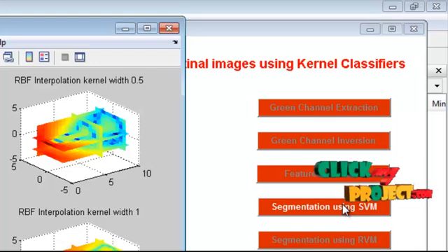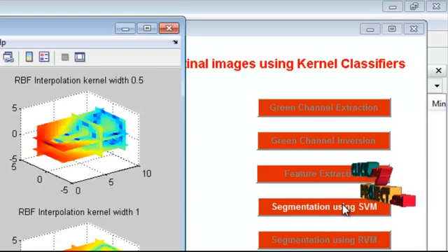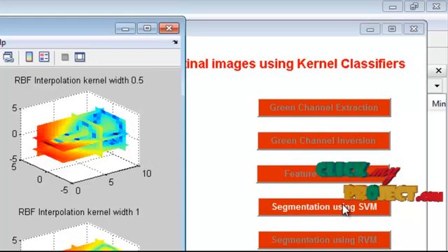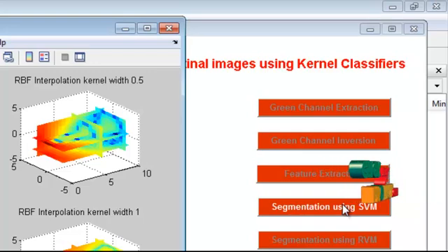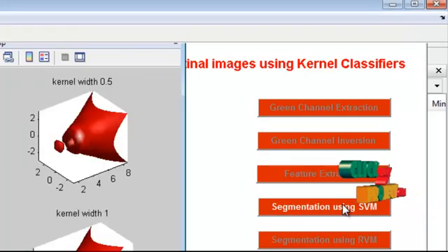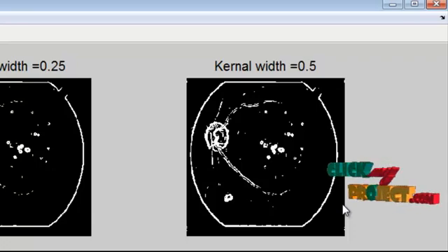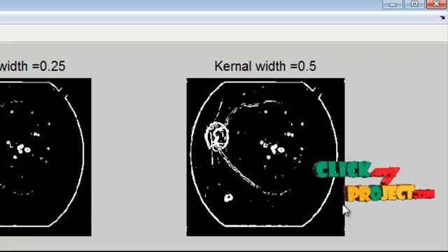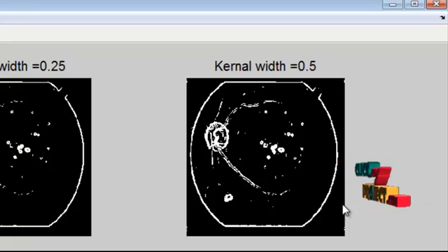Here we have obtained the RBF interpolation kernel width graphs for different kernel width sizes: 0.25, 0.5, 0.75, and 1. This is the segmentation result of SVM using various kernel widths.